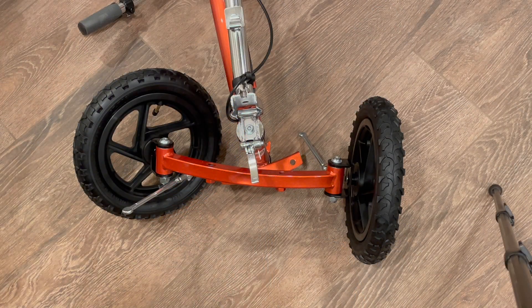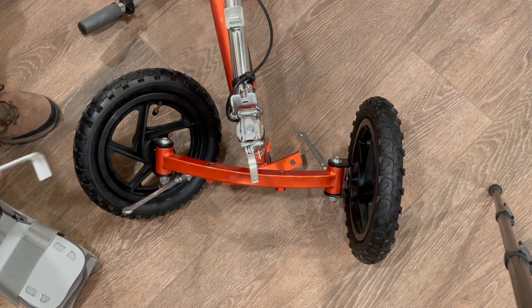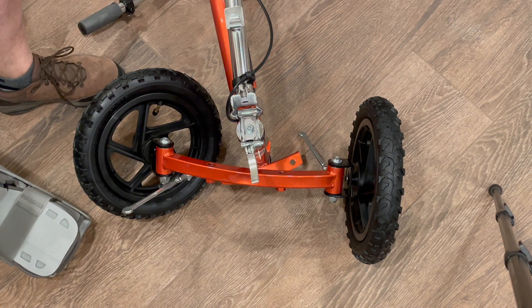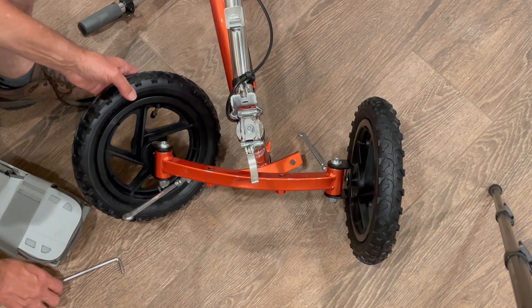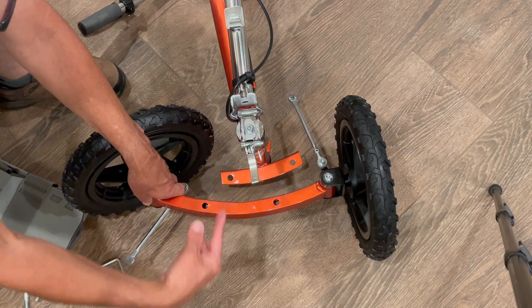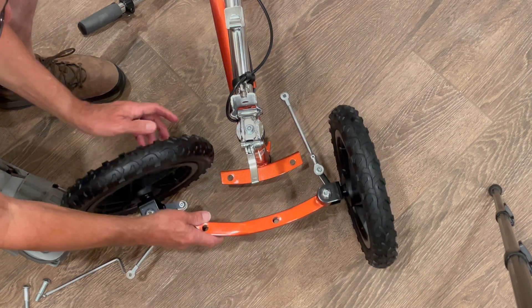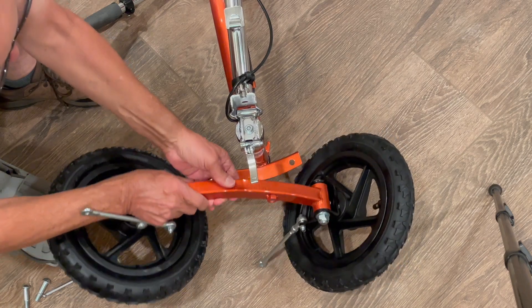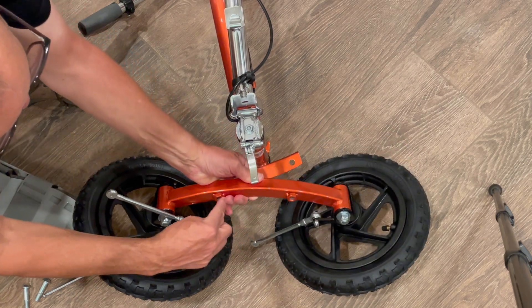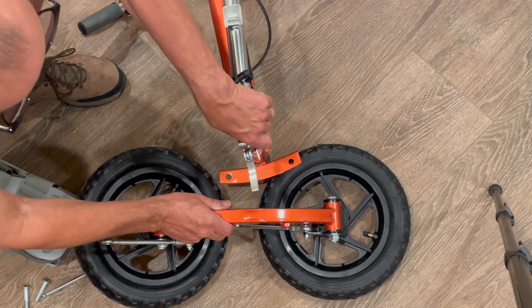Now we're going to look at the front axle. You can see it kind of bows out if it's facing forward — that's the correct position. If I move this from side to side, you can see this bow is outward, and it slides back into the sleeve that has a similar bow. If you see these nuts and have it arranged so they're upward, you're wrong — they should be going down.